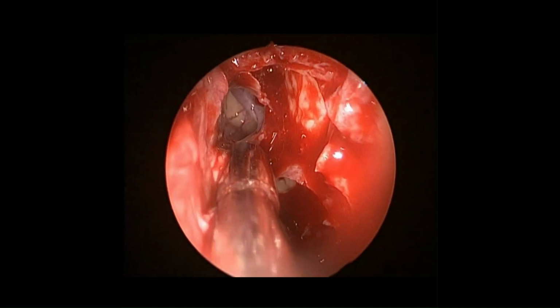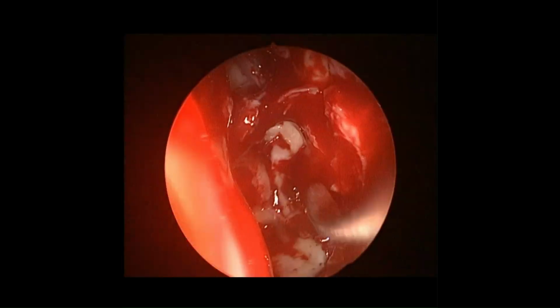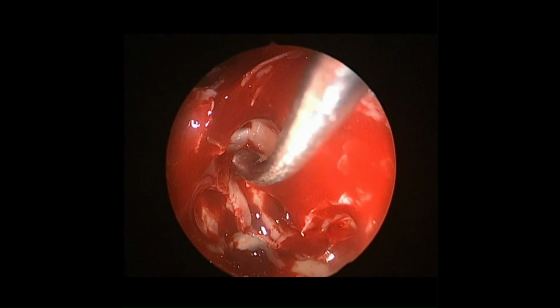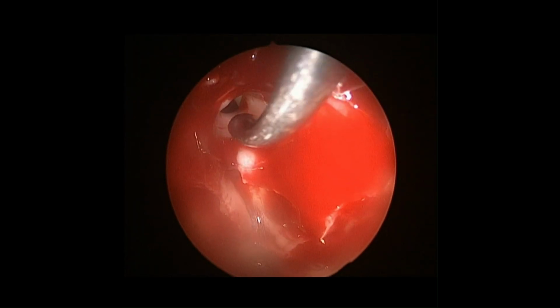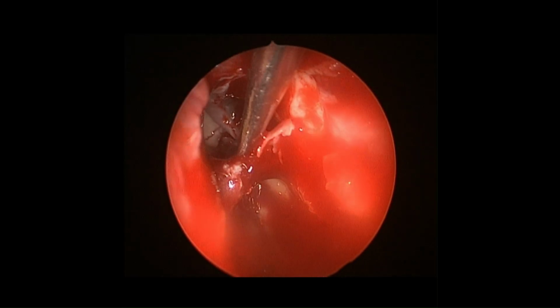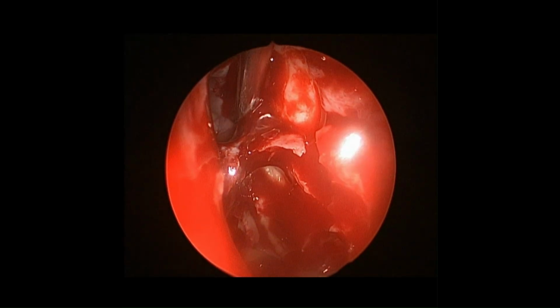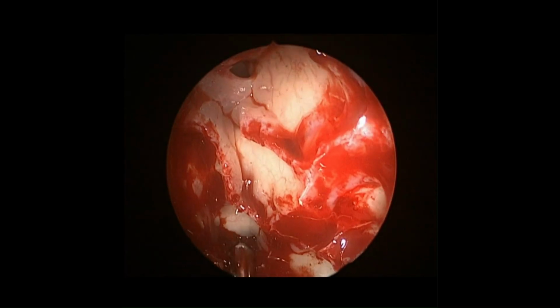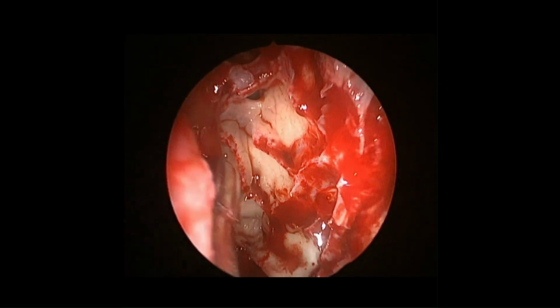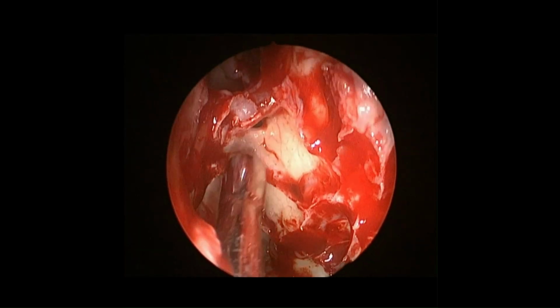The third step is, after complete removal of the agger nasi cell, the frontal sinus ostium becomes clearly visible, located immediately above and posterior to the agger nasi cell. Actually, the frontal recess boundaries are, posteriorly, the anterior ethmoid artery, which is shown here lying just posterior to the superior attachment of the anterior wall of the ethmoid bulla. Here the artery runs from posterolateral to anteromedial within a mesentery at the skull base.